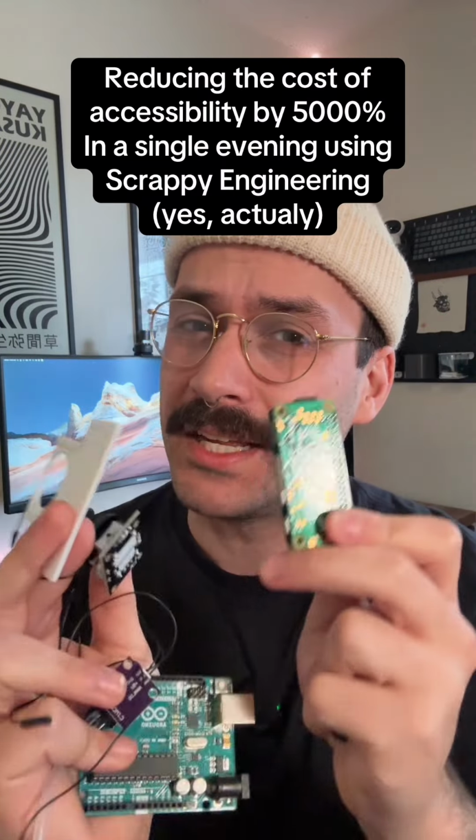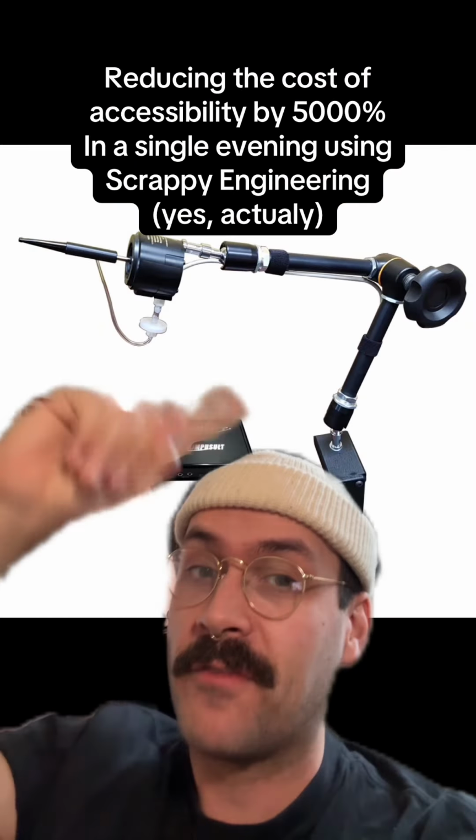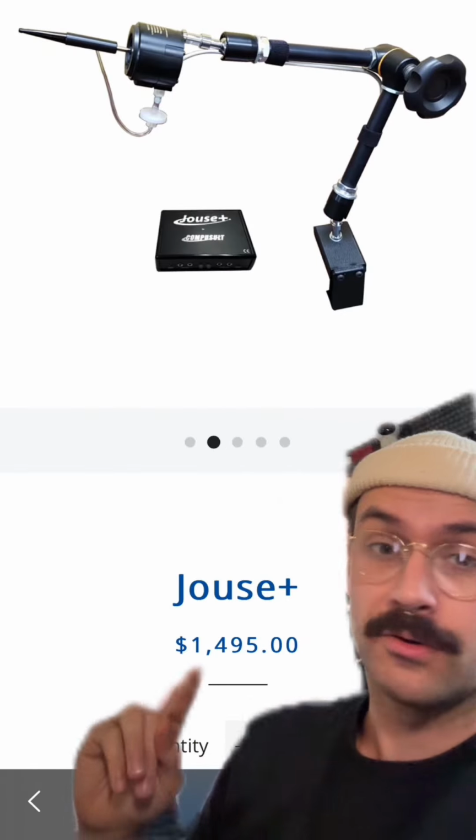Let's counteract all the negativity in the world right now by building something to help others. So this is called a Sip and Puff mouse. It's an accessibility device for people with motor issues in their hands. There's this joystick you control with your mouth, and then you could sip in or puff out to click or right click. Incredible device. Unfortunately, they're prohibitively expensive at like $1,000 plus. So we're gonna try to build our own for under $40.